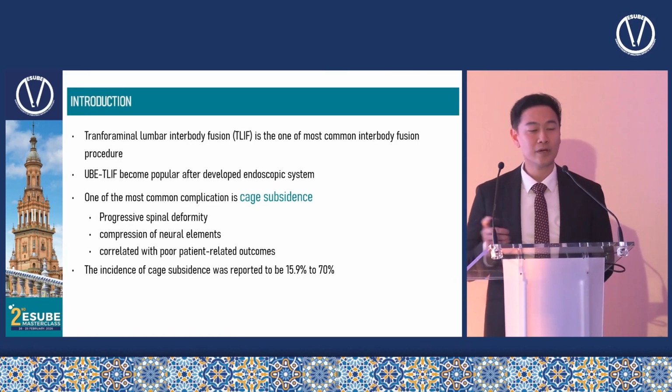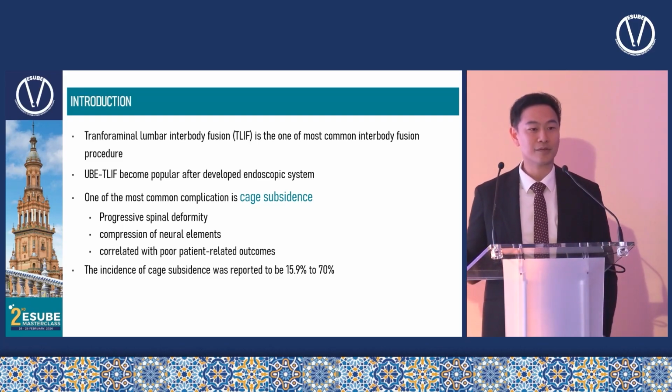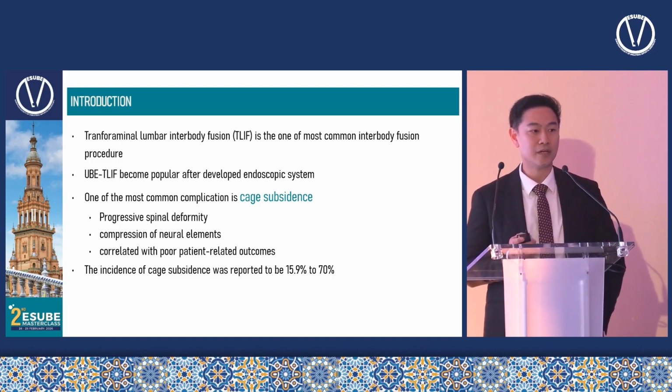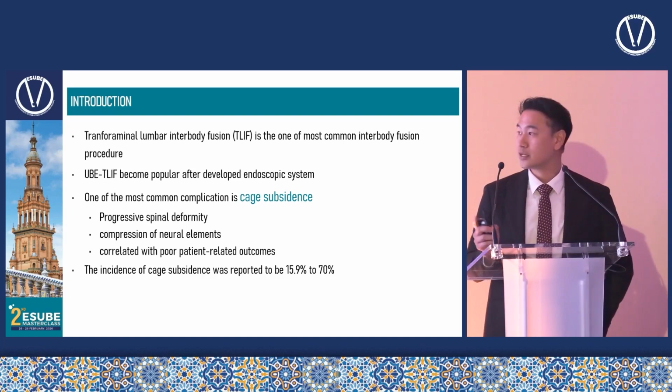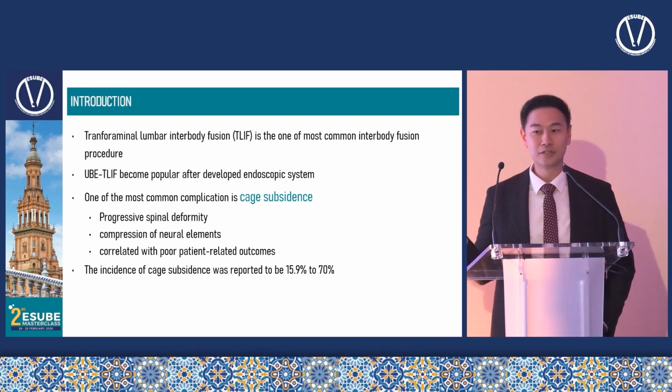The TLIF is one of the most common procedures of interbody fusion, as we know, because of the favorable outcome and result. But in this decade, endoscopy has been developed and become very, very famous. The term UBE TLIF, I think, is not important to describe.